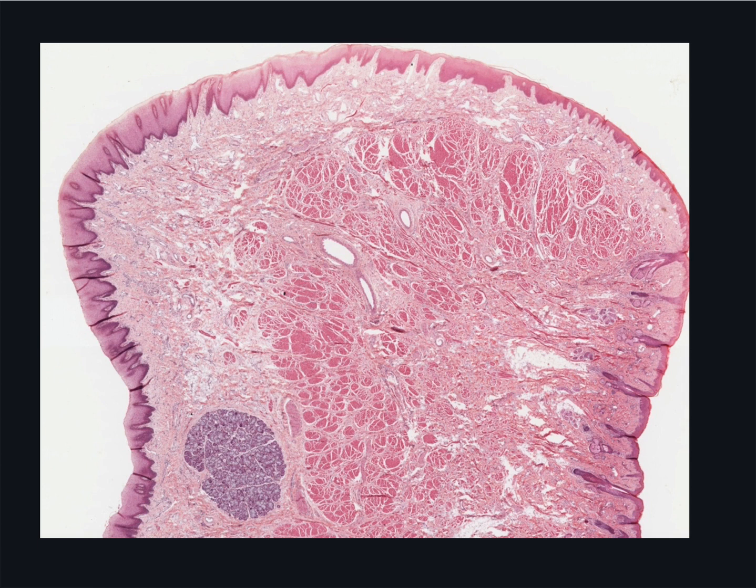Most of the oral cavity is lined with an oral mucosa, characterised by non-keratinized stratified squamous epithelium, and mixed serous mucous glands are located in most places underneath the epithelium. The inside of the lip exemplifies this oral lining. Look at the epithelial surface here on the lingual side with the thicker epithelial layer, and now this external side with a thin epidermal layer, typical skin epidermis.